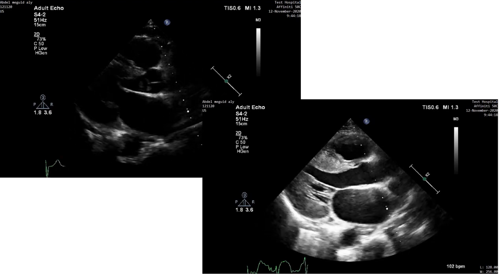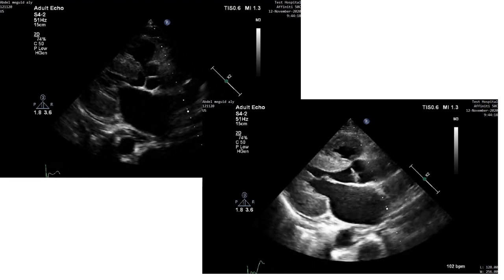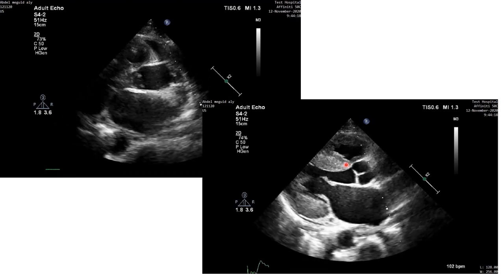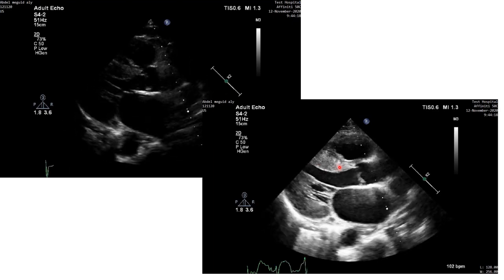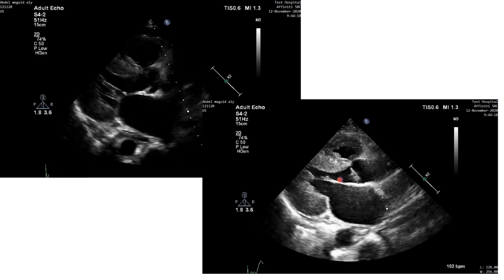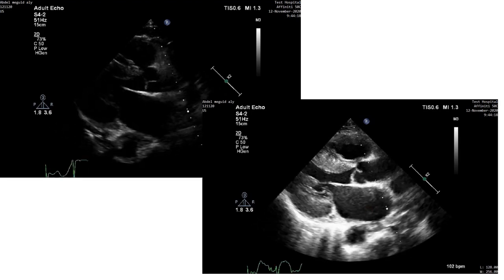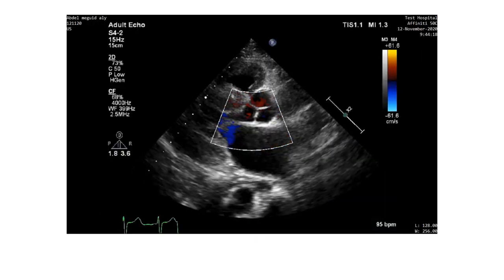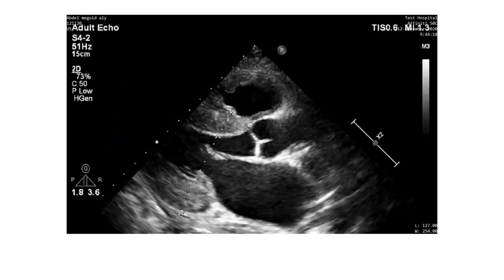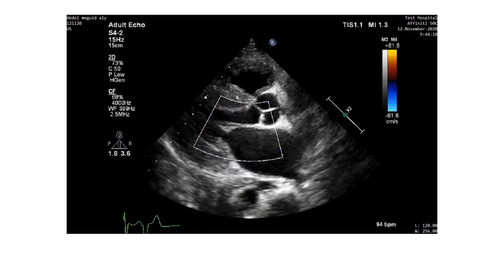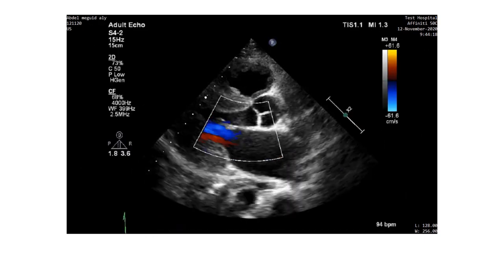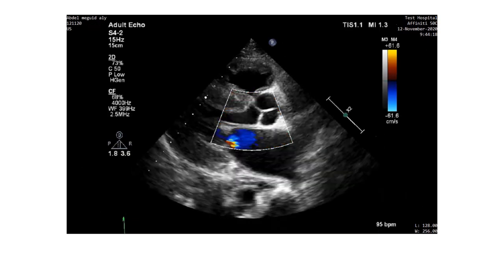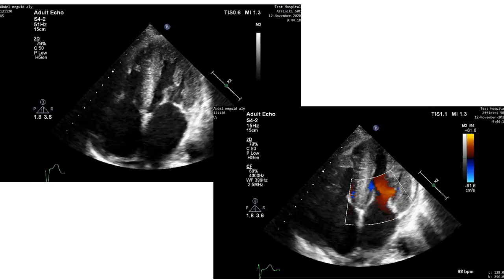These are the first videos of echocardiography parasternal long axis view. You can appreciate by the first look that there is significant left ventricular hypertrophy, in addition to the speckling, sparkling, glistening myocardium. Again, parasternal long axis view this time with color Doppler, showing no mitral regurgitation and no aortic regurgitation, but there is a significantly dilated left atrium.